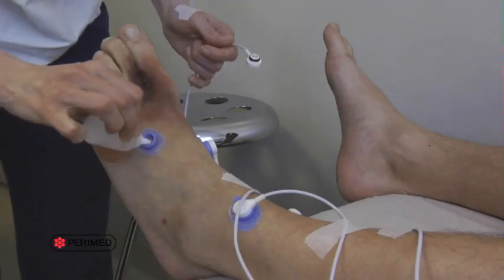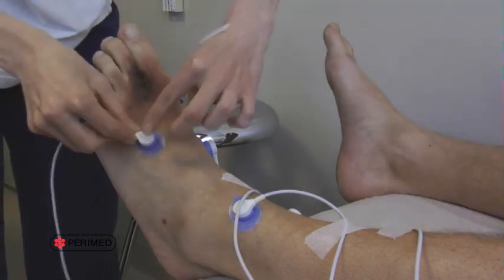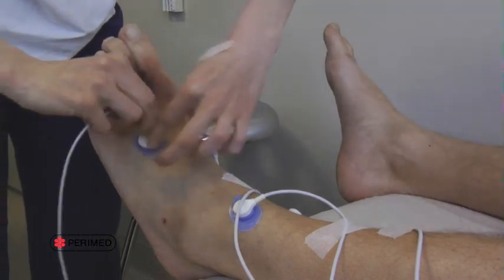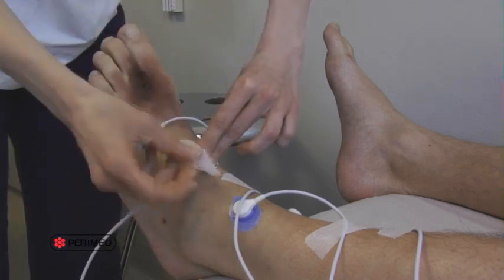Now let's discuss using tcpO2 to assess wound healing potential. On the foot, while breathing normobaric air, that is air at ambient atmospheric pressures, the average tcpO2 in a healthy person is always greater than 50 millimeters of mercury.